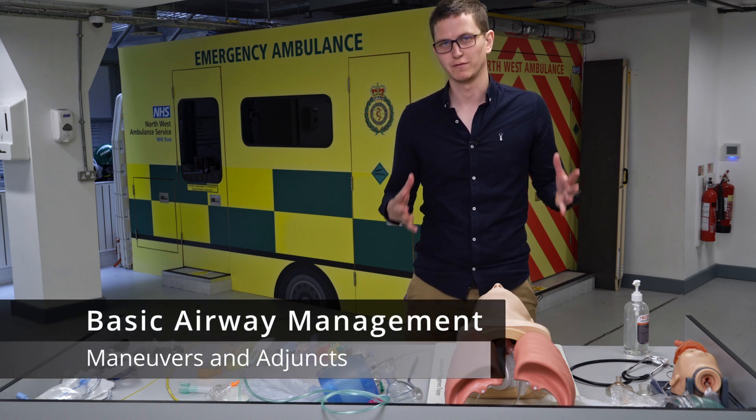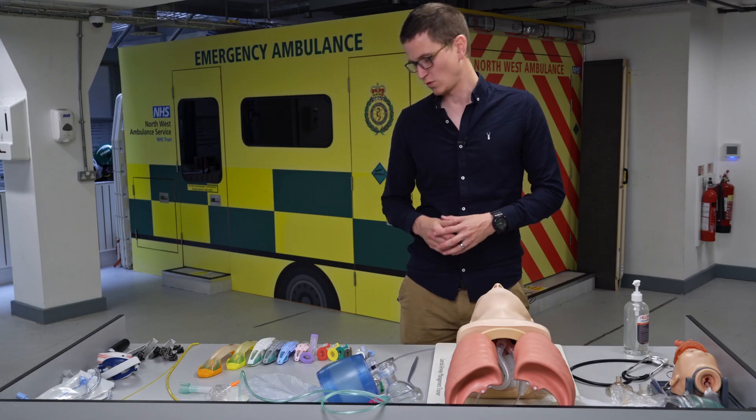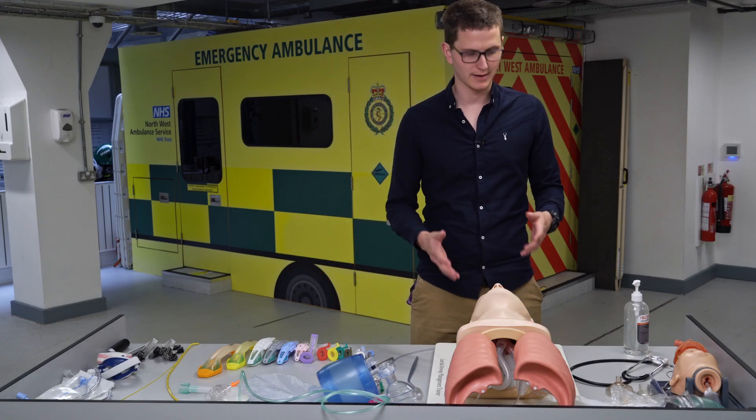Good day and welcome to the basic life support video. Today we're going to be talking about head tilt, chin lift, jaw thrust, and all the basic airway adjuncts: NPA, OPA, BVM, and airway suctioning.